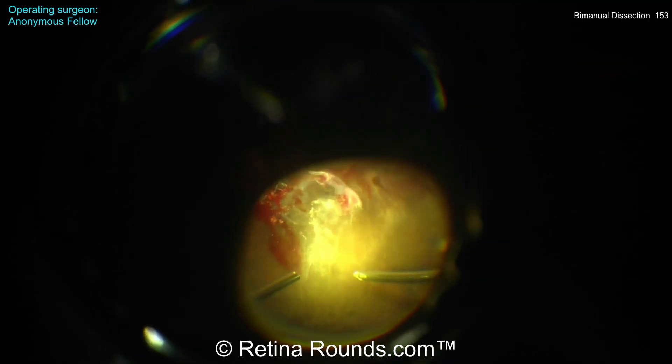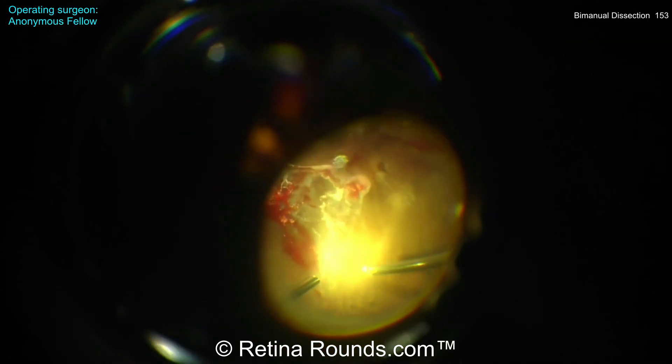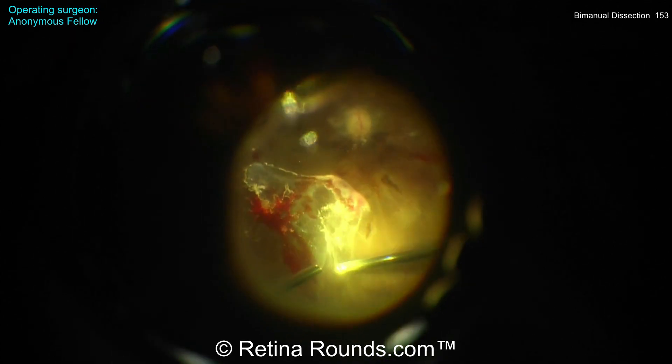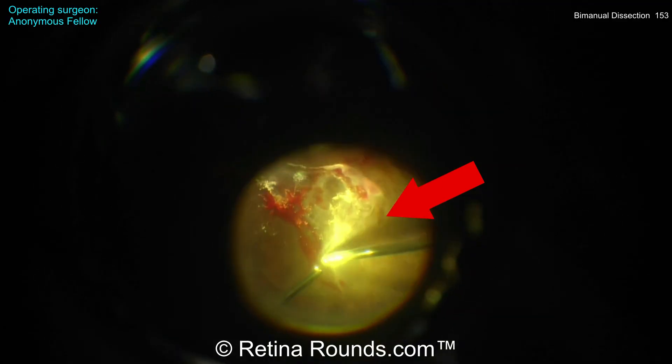Now using the vitreous cutter to elevate the anterior edge of the hyaloid and debulking some of the vitreous anterior to this fibrovascular membrane. And you can see here as the cutter is being pulled, there's another iatrogenic break — a slit break that's created there.